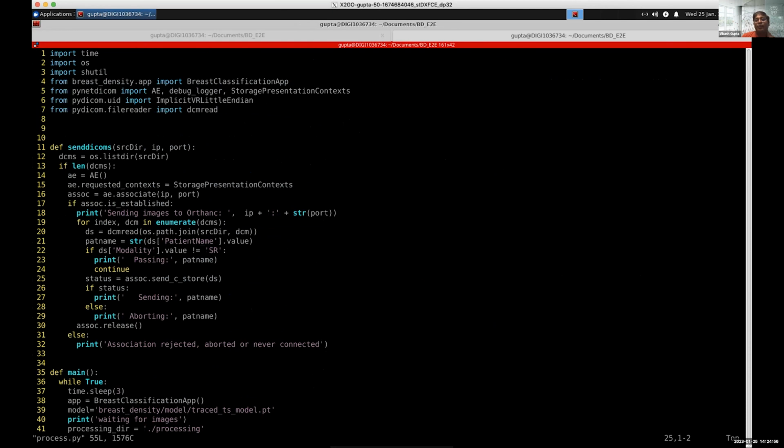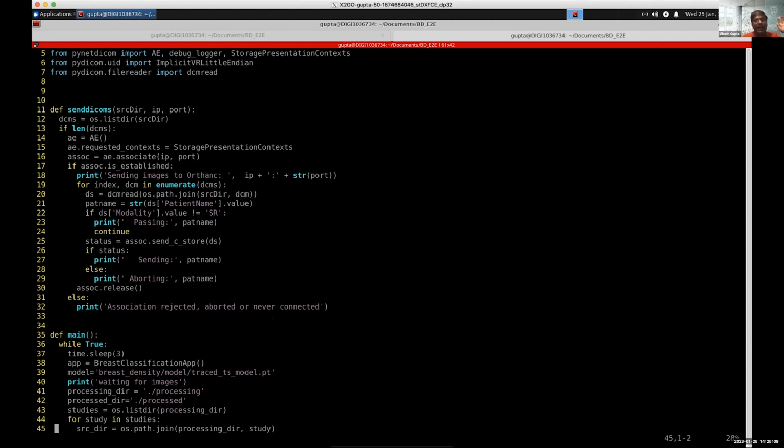Yeah, I'll say MONAI Deploy Express is super easy to use. Victor Chang did an amazing job. You can download it and it runs out of the box, I can assure you that. It's really amazing. I love it.